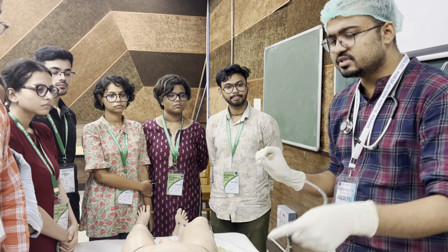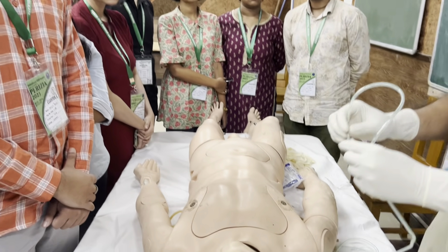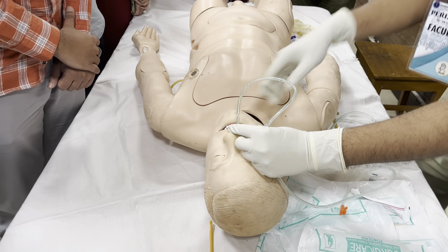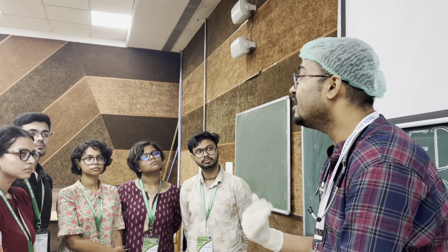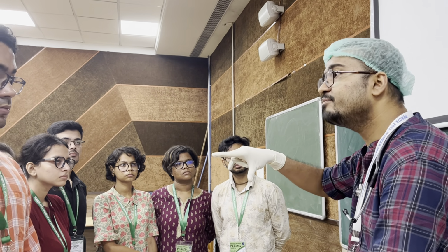Okay, now I am choosing this nostril. I am going to insert this tube. Usually when I insert, the tip will first touch the pharynx, then the patient will gag. That means now the tip is in the pharynx. Then I will ask the patient to swallow the tube, so that there will be closure of the inlet of the larynx.